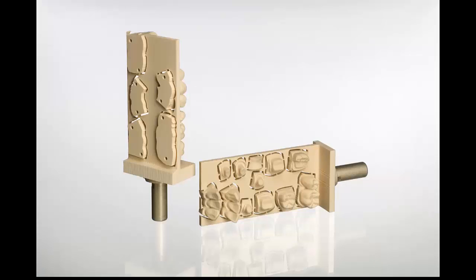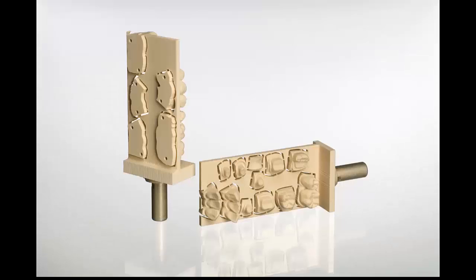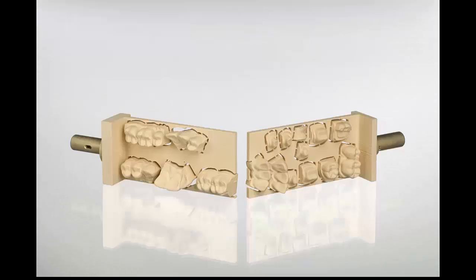will get an error. What you need to do is take the water tank out. I make sure that the tank is not too dirty, because you get the error message for both. And I would just top up the water tank. Also, when you insert a new tank, some of that water fills the pipes, and that reduces the water level. After a few mills, you would get the message of low water level. You just need to top up the water.